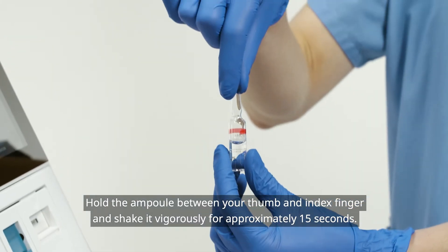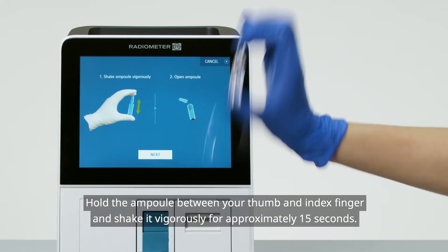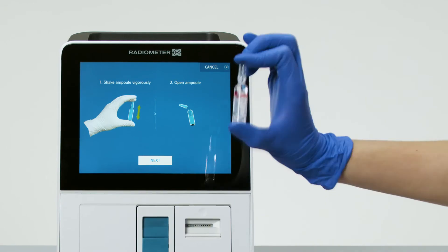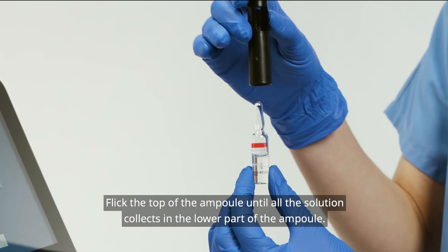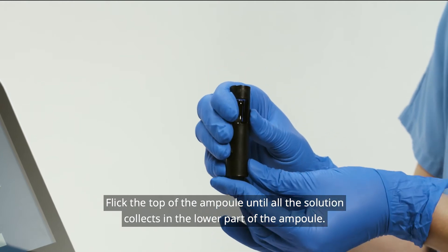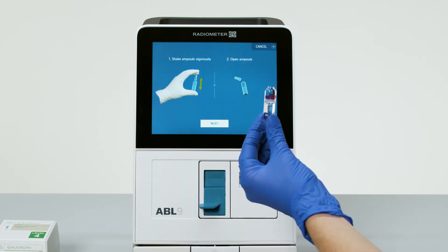Hold the ampoule between your thumb and index finger and shake it vigorously for approximately 15 seconds. Flick the top of the ampoule until all the solution collects in the lower part of the ampoule. Open the ampoule using the ampoule opener and press Next.